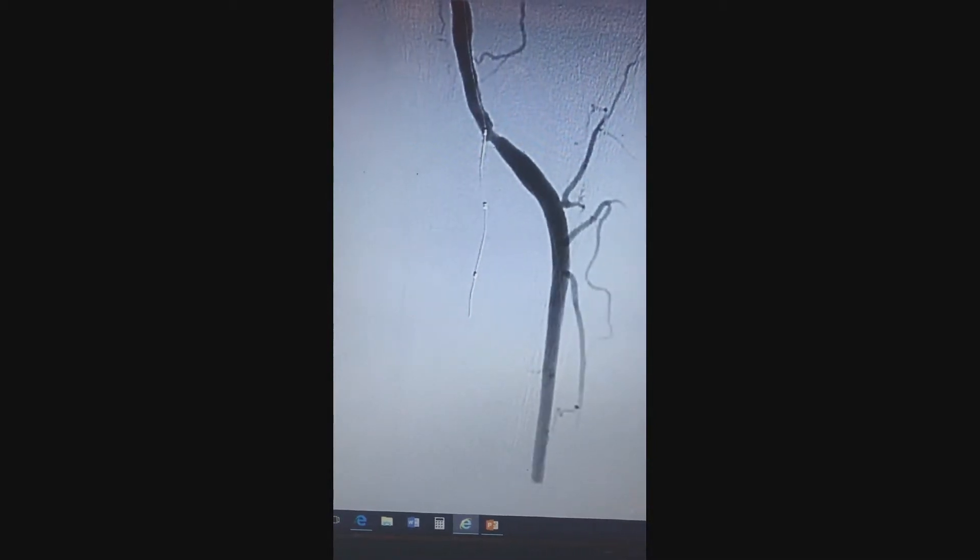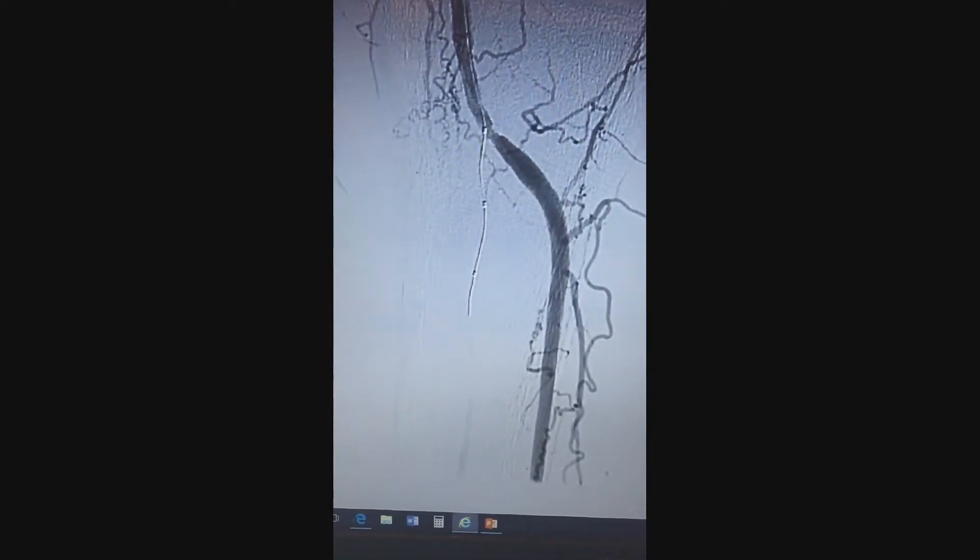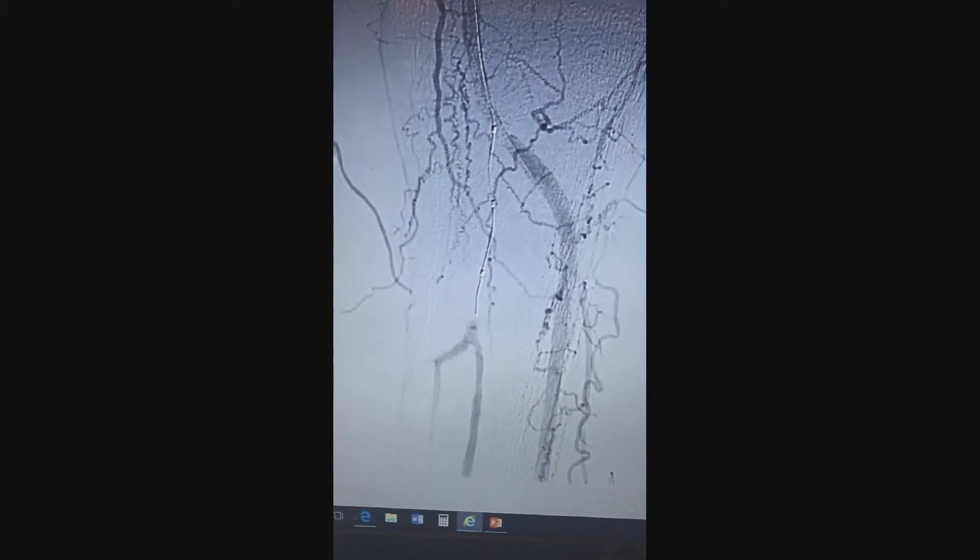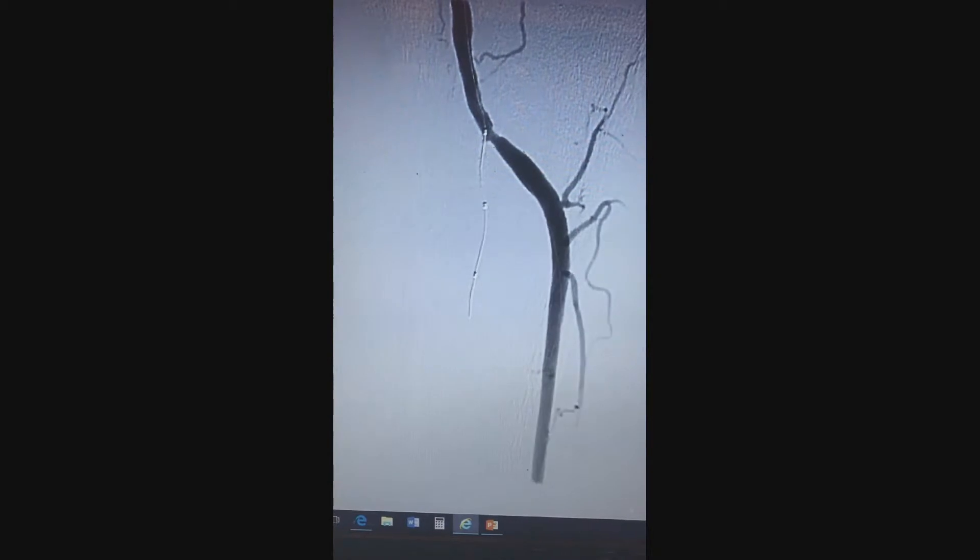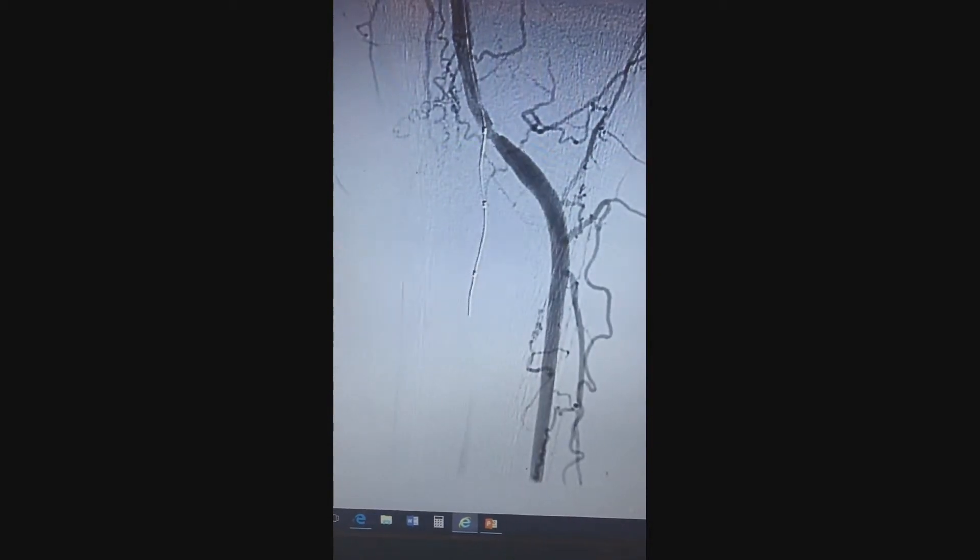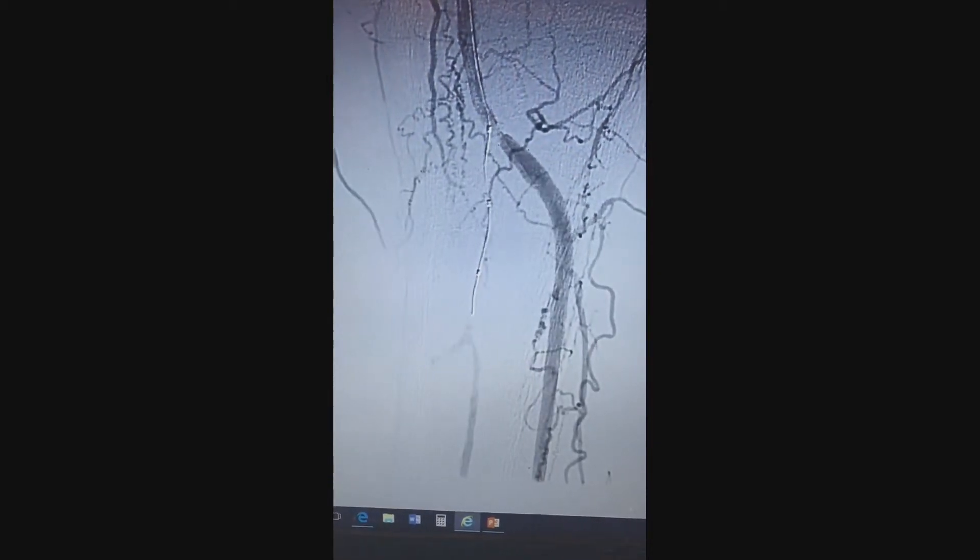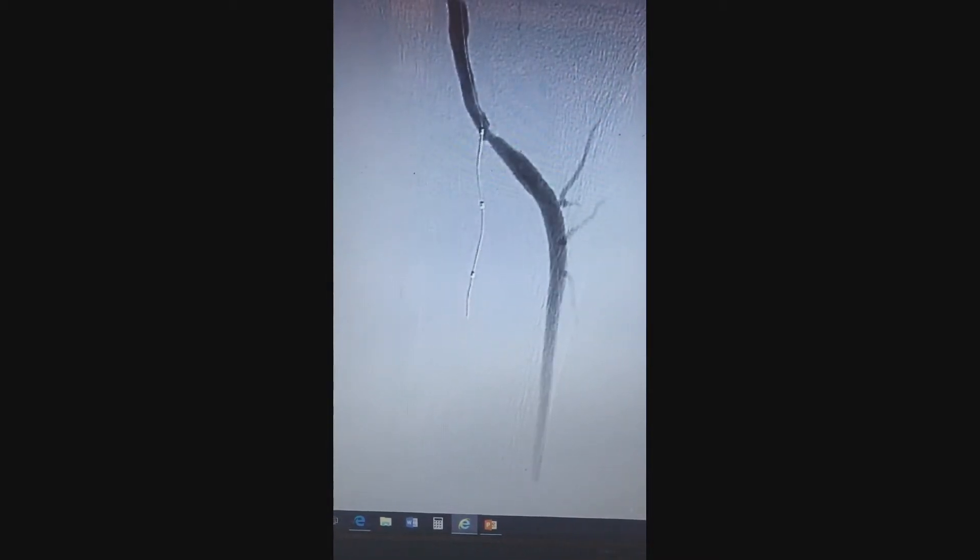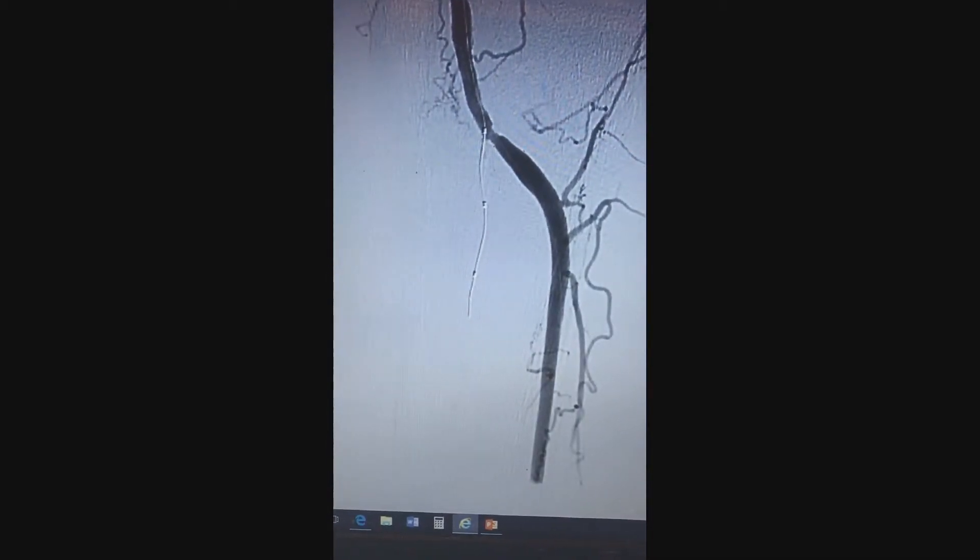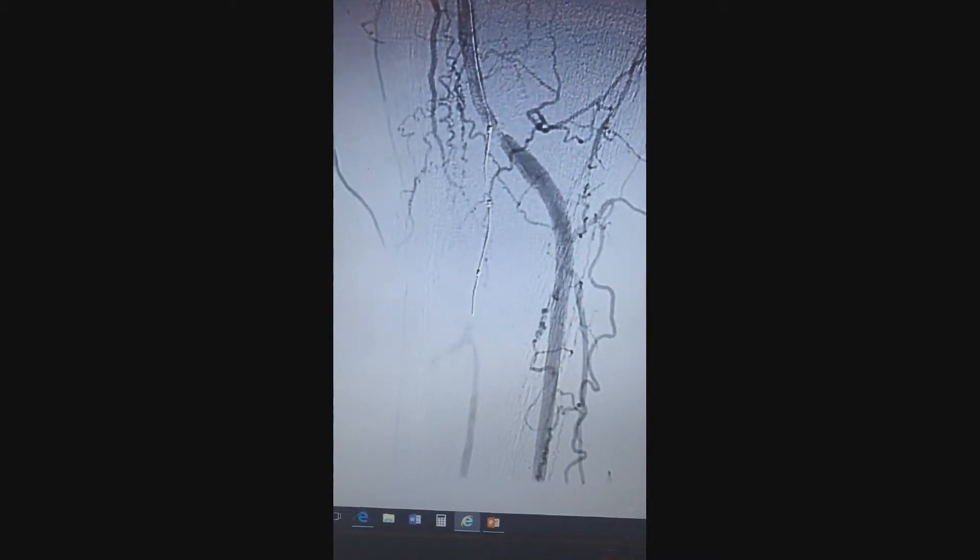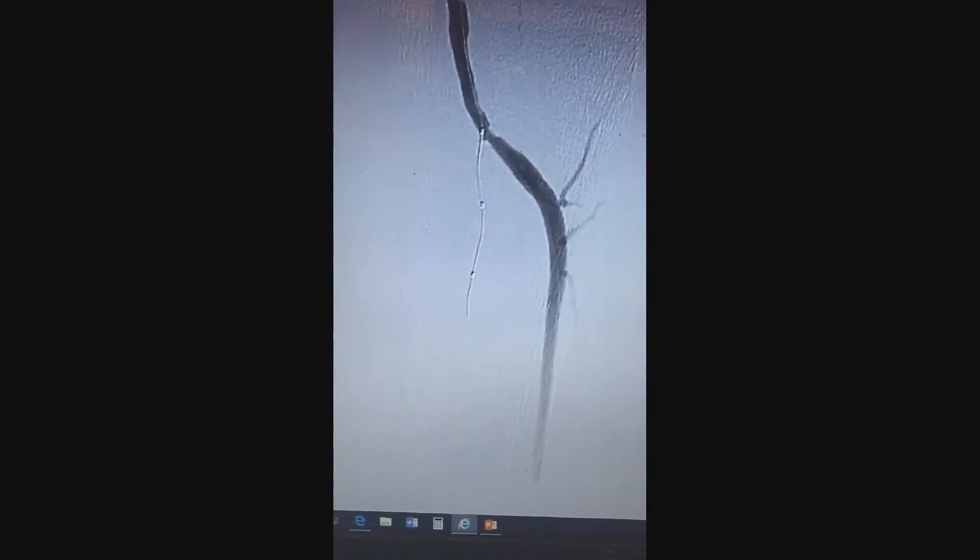There's a wire down the anterior tibial, and then this was an 018 quick cross with a command wire that was able to cross through the lumen of the tibial peroneal trunk and was able to cross all the way to the segment. And then this is where I got stuck. The wire would not go any further. It was in the sub-intimal level here.